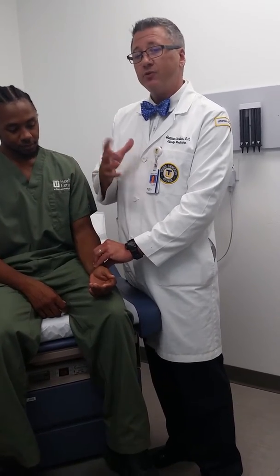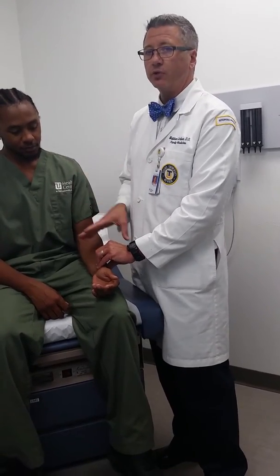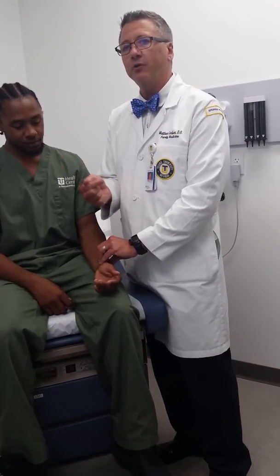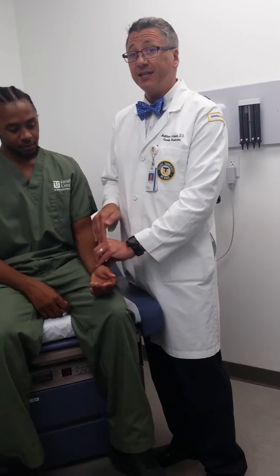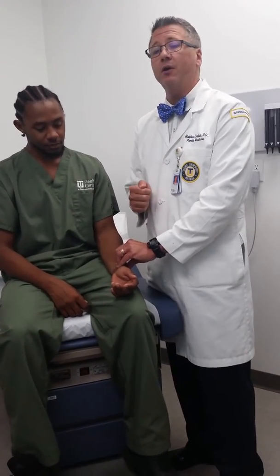Most of the time I will use 15 seconds because it's a good middle number. If the heart rate is really super slow I'll go a little bit longer; if it's really super fast I can go a little bit shorter. Once I've gotten the count — which was 15 — I'm going to multiply that by 4 because I counted for 15 seconds, giving me a heart rate of 60.